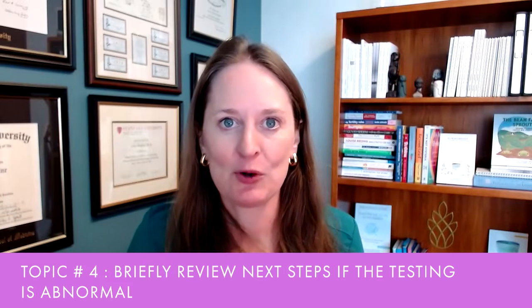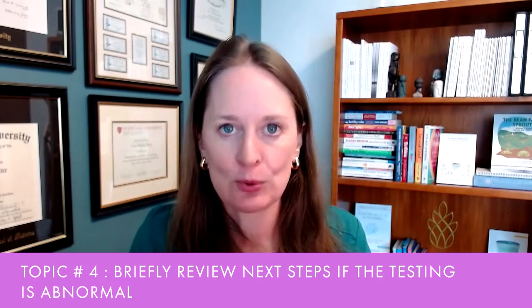So topic number 4, what do you do if the testing is abnormal? This absolutely depends on your personal situation. Remember, the hysterosalpingogram and the saline infusion sonogram and the hysteroscopy all have pros and cons and exactly what they're looking for. So in general, if you have an abnormal finding on a uterine cavity, a filling defect on your hysterosalpingogram or your saline infusion sonogram, most likely the next step is a hysteroscopy to really diagnose it. And if there's a polyp there, treat it at the same time.